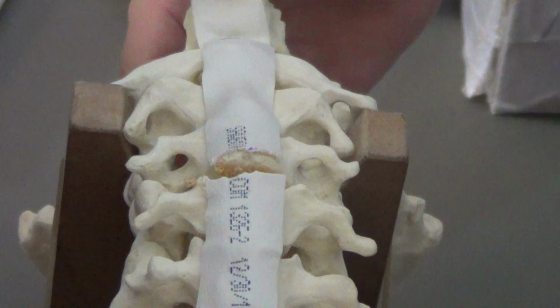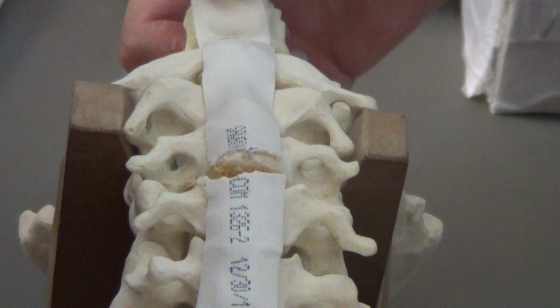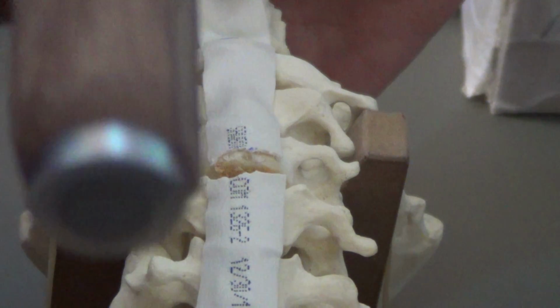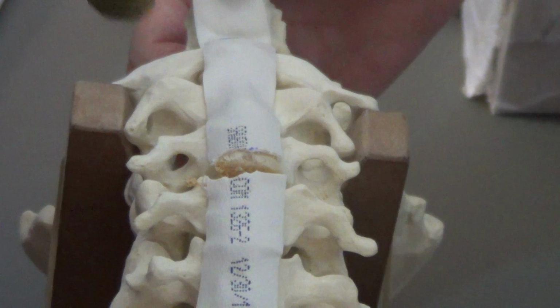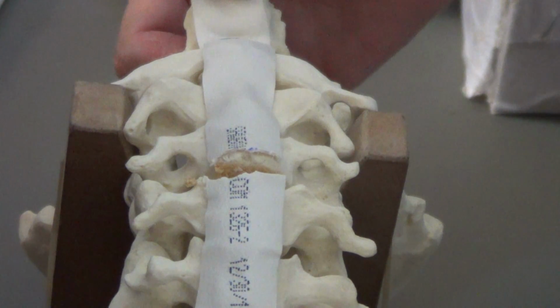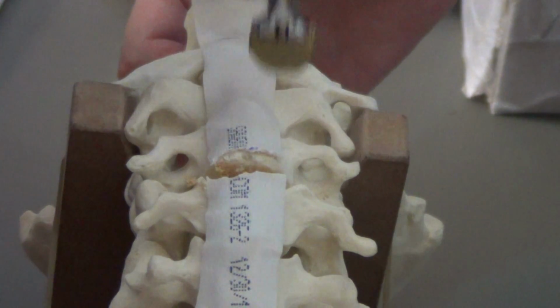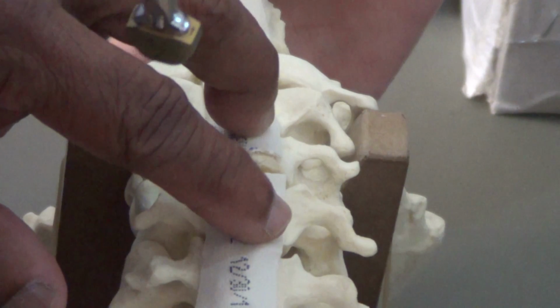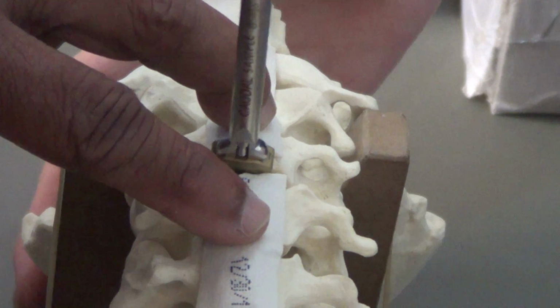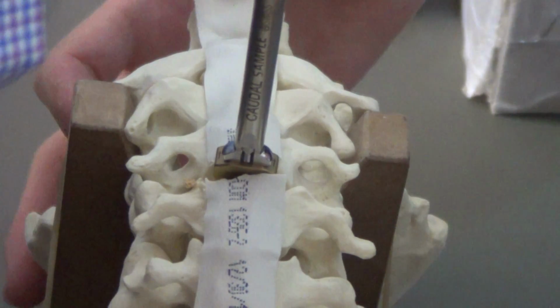And then how do you check which size of cage to be put? Usually the instruments will have different sizes of cage. The smaller size is 5 mm, and then you put a 5. It is very important that you see at this point your disc space is distracted. So you must see that once you put it, it is snugly fit, then you release the distraction.